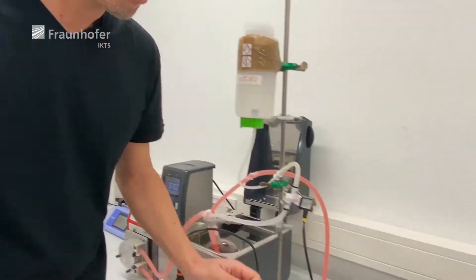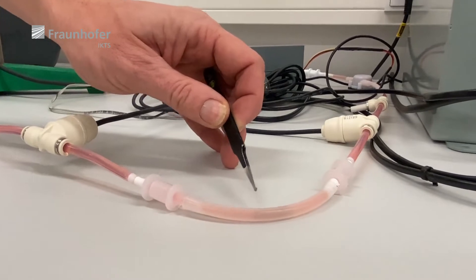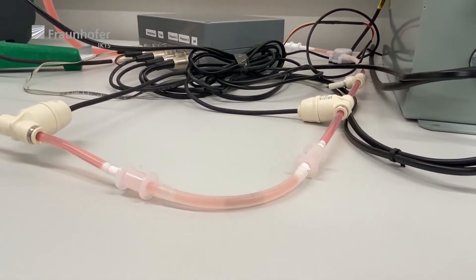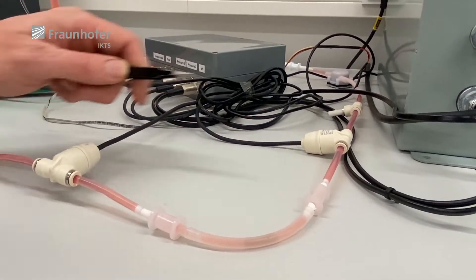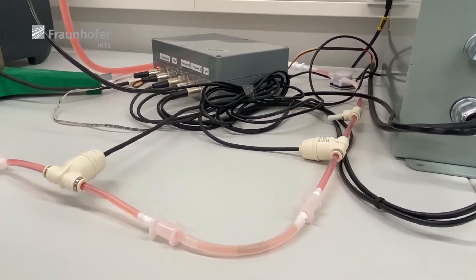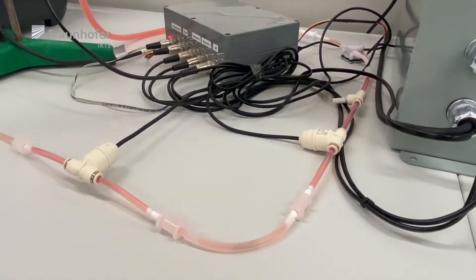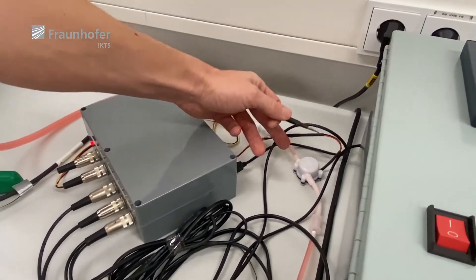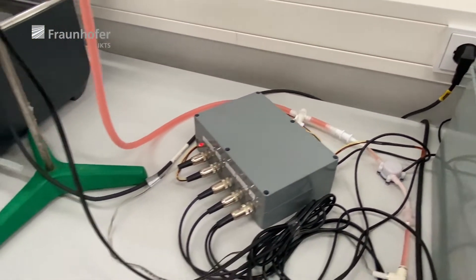The stent is placed here in a small silicon tube — here the stent is visible. Before and after we have two pressure sensors, so if something clogs up or anything happens, we can see a difference in pressure before and after. Here is a temperature sensor, here is a sensor to measure the flow rate, and lastly the pH sensor.